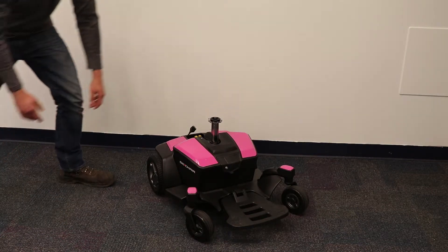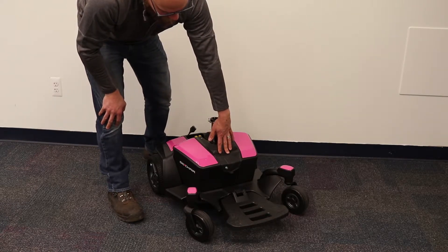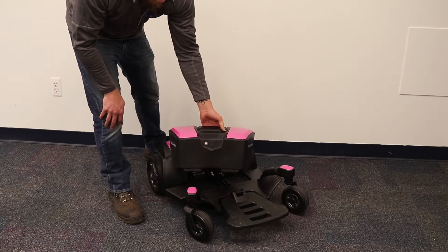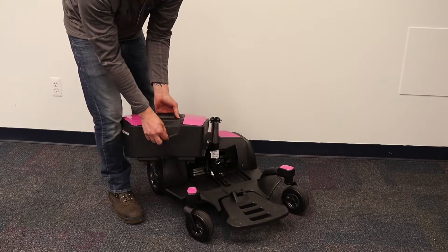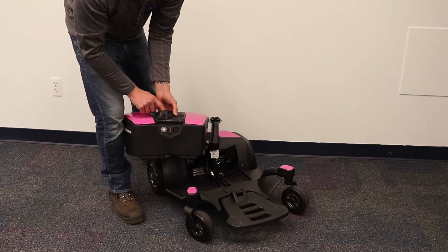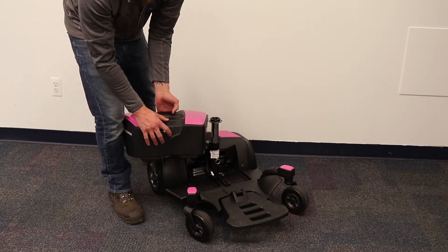Next, we have the battery. As you can see, there is a handle in the front and you can lift up and remove the battery from the base of the chair. Also, note that you can charge the battery directly here in front of the battery box. This is especially handy if you are traveling and you don't want to bring the entire power chair in to charge — all you will need is the battery box.